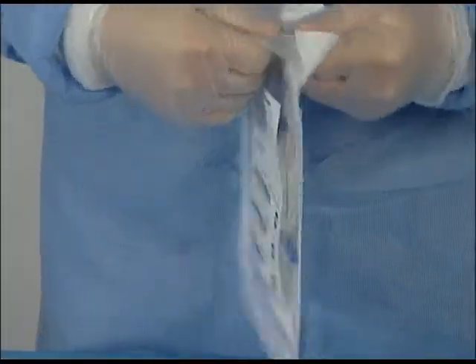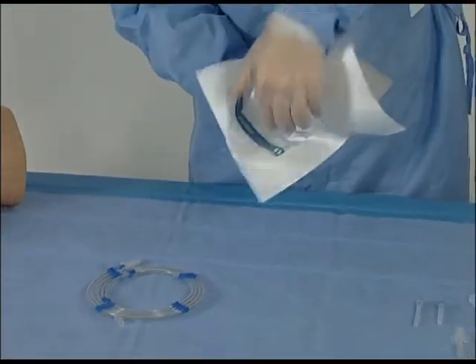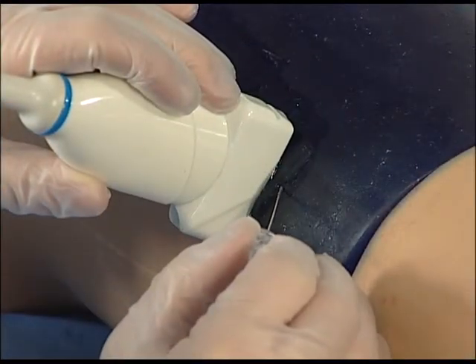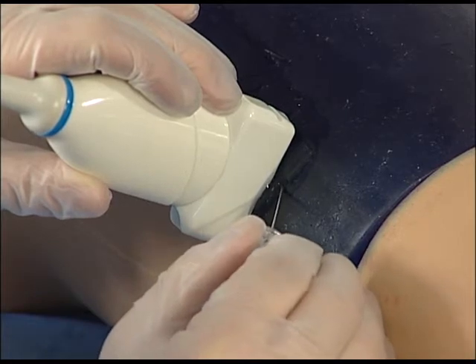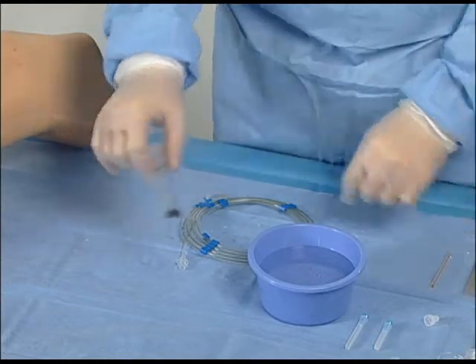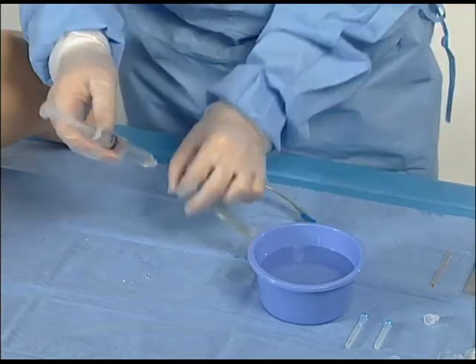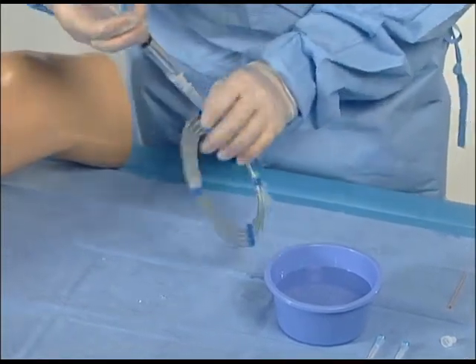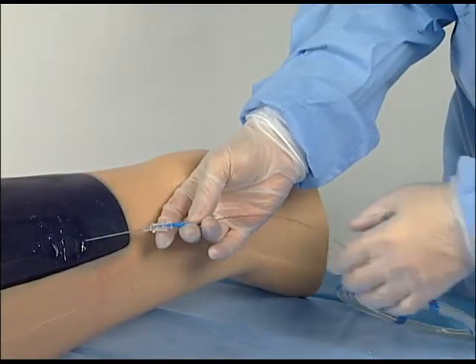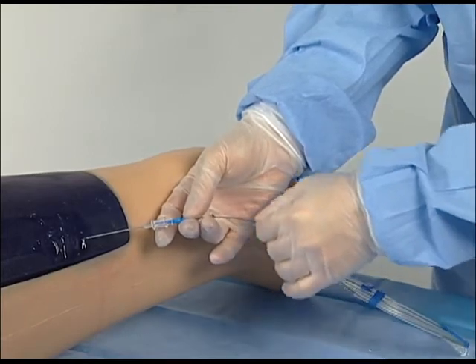Open the access kit or pack A and remove the 19 gauge access needle and guide wire. Internal packaging is sterile and may be placed in the sterile field if needed. At the desired access site and under ultrasound guidance, use the access needle to gain entry to the target vein. If desired, draw up saline into a syringe and flush the guide wire coil to lubricate prior to use. Using the introducer, insert the guide wire into the needle hub and into the vein, advancing to the desired point under ultrasound guidance.